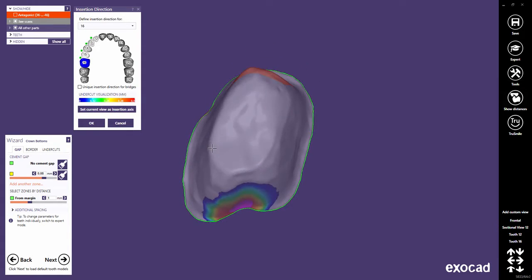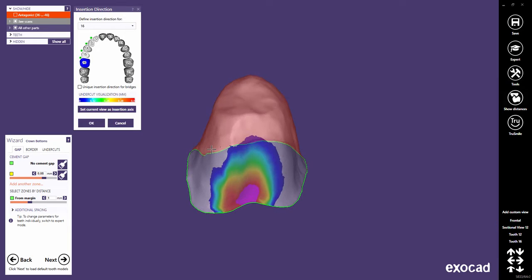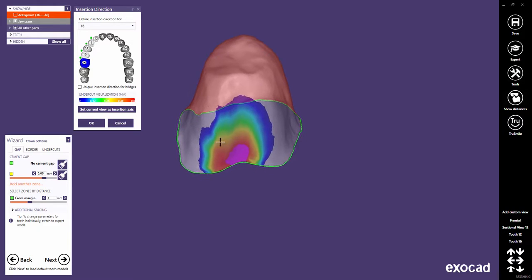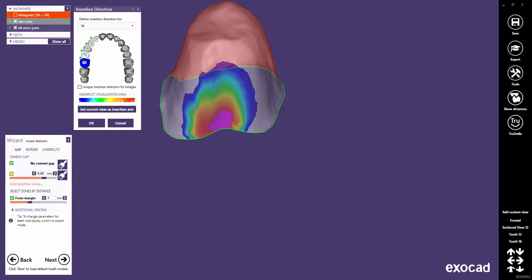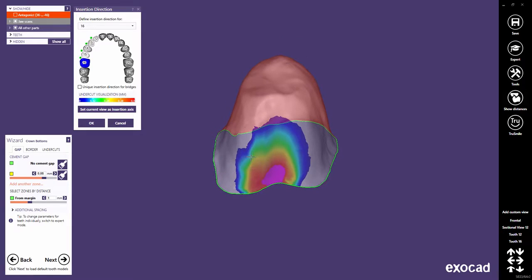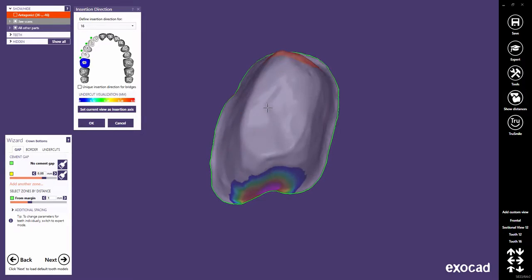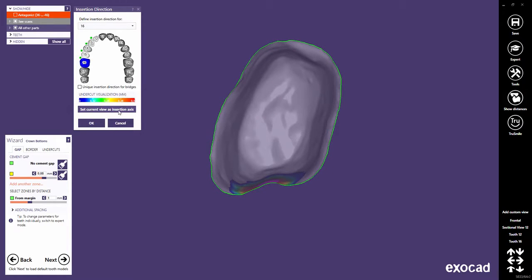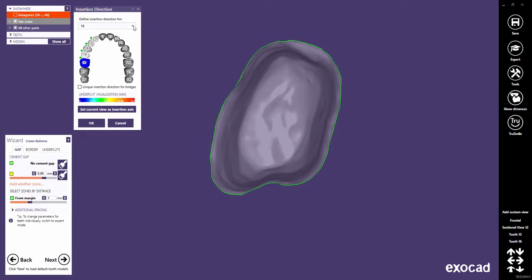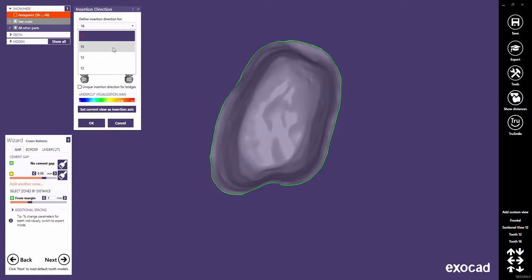Once the insertion axis has been applied, the depth of the undercuts will be displayed corresponding to the color scale. Use the drop-down menu to switch to another tooth and correct its insertion axis.